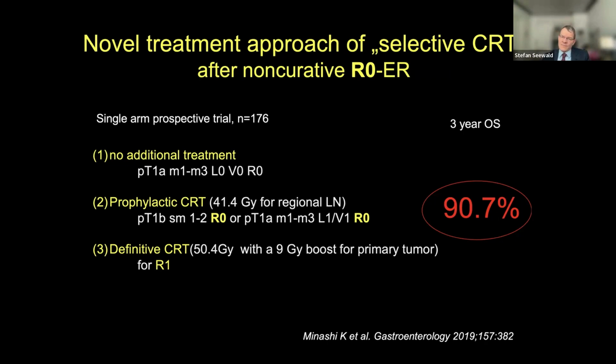I think the point is which patient group you have to look at more precisely. These are patients who are smokers or patients with ENT tumors. You have to check the esophagus. So this is still an open question, which patient group we have to preventively perform an endoscopy on.